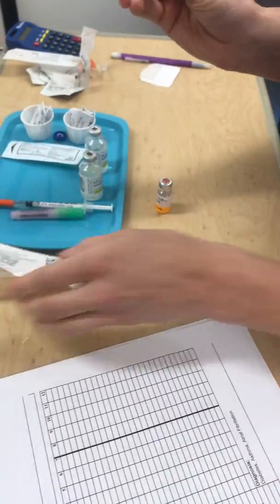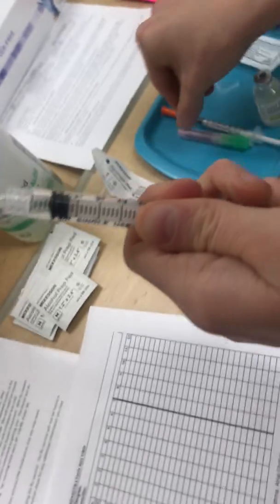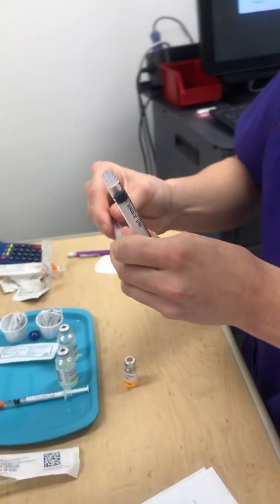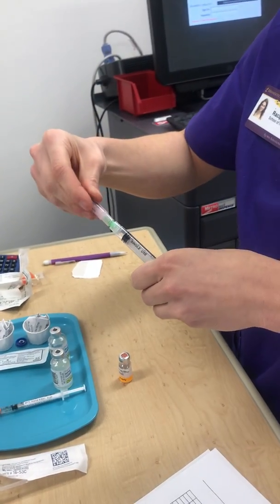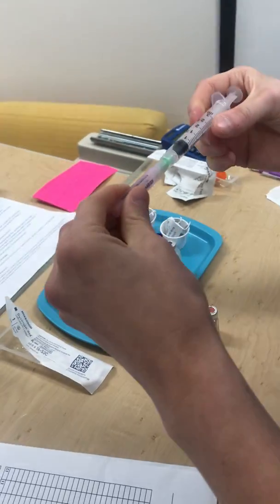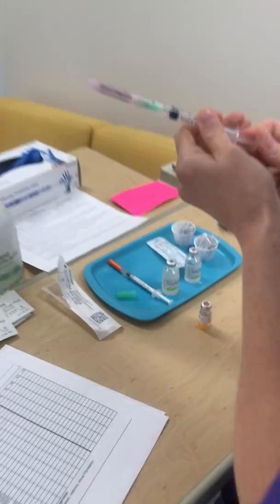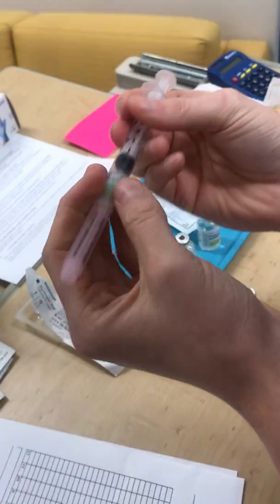So we need 0.5, so I'll put that 0.5, and then I'm going to snap this off, and then we're going to use our filter needle. Perfect. And then, yep, again, that's exactly how much air I need to inject.